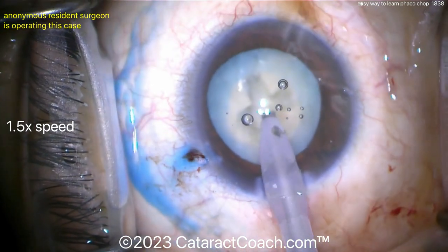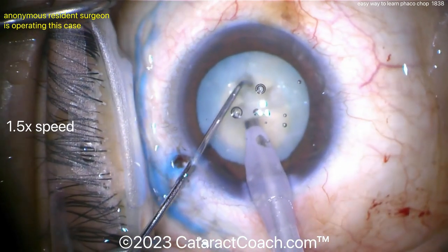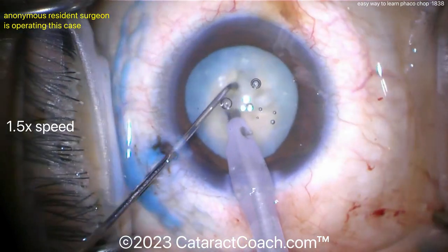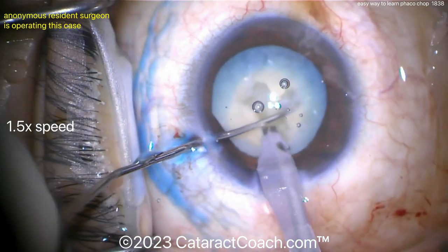Going inside the eye and rotating again — this is going to be a full four-quadrant divide and conquer. For a resident doing this case, this is a very reasonable technique: a four-quadrant divide and conquer.